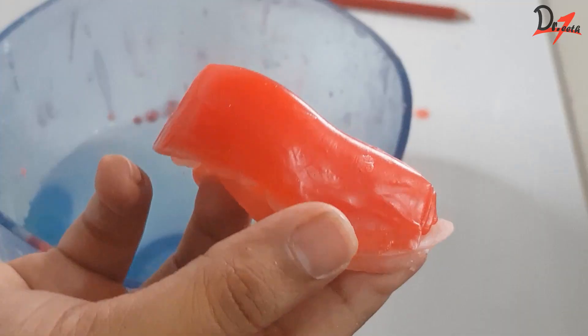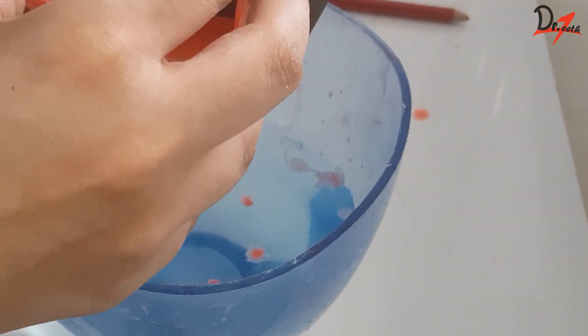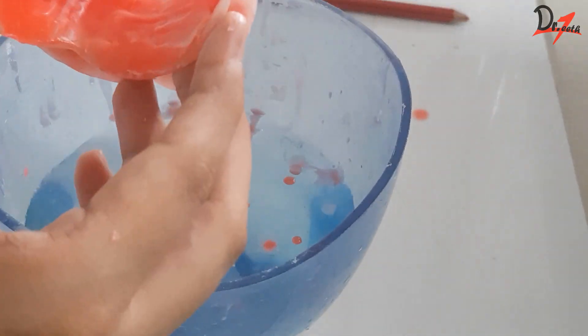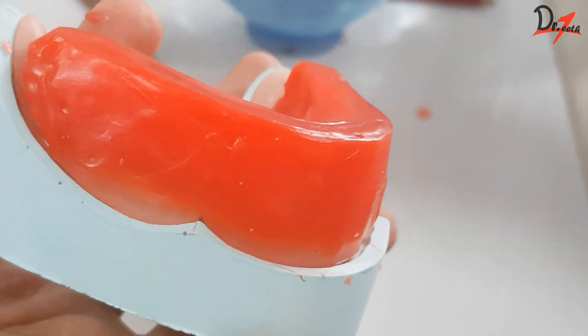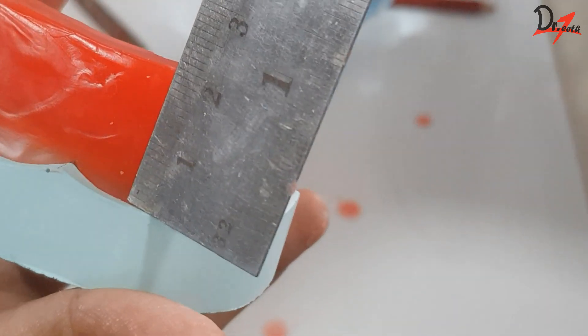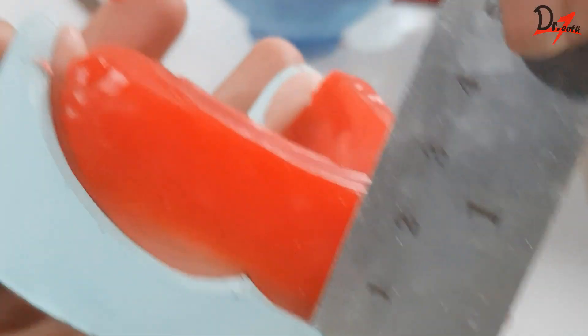For the height, we will take a hot plate, heat it, and run it through the occlusal surface so that we get an approximate height. Once you begin making rims, we will measure the height from the depth of the labial sulcus. The height of the rim from the depth of the labial sulcus should be 18 mm.